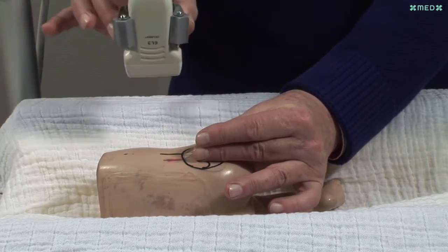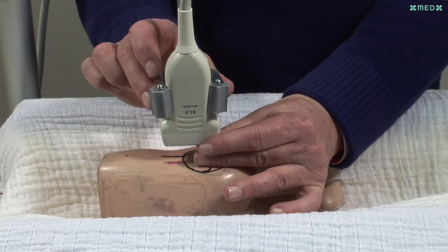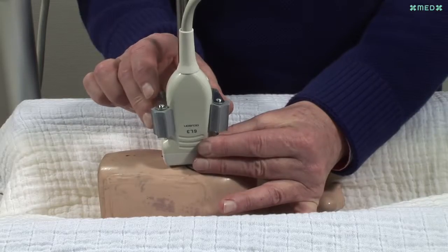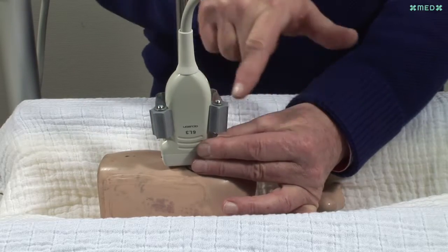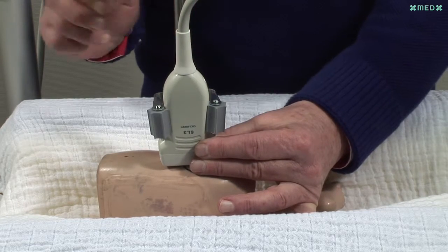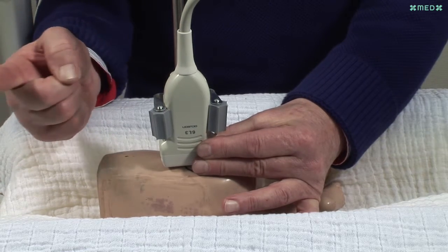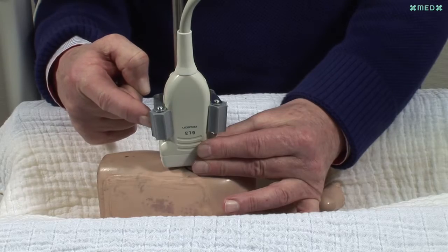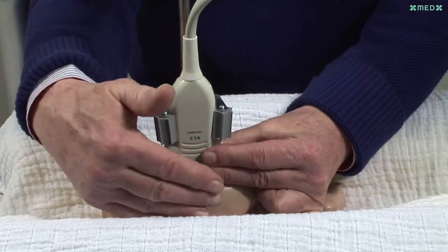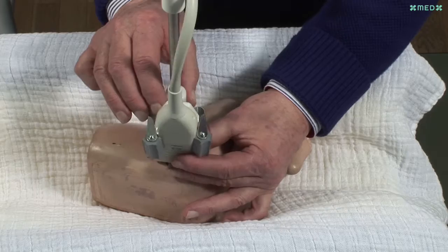The transducer is held with the right hand and placed in between the fingers of the left hand. Directly underneath the transducer are the greater trochanter and the hip joint. The transducer is held with the fingertips only. The right hand is placed onto the cradle and the index finger helps stabilize the transducer. The longitudinal axis of the transducer has to be parallel to the sides of the cradle and should not point towards the spine.